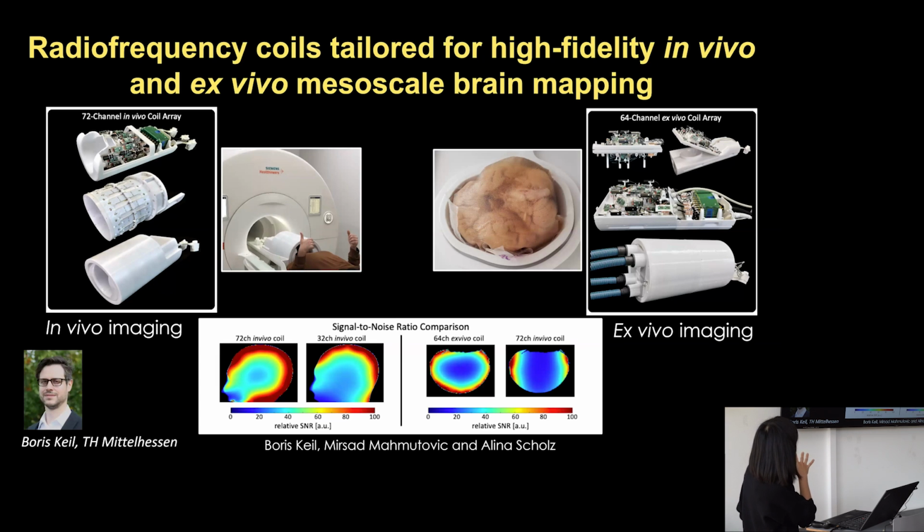In terms of the radio frequency coil, these were also very elegantly designed by Boris Keil, who's now in Mittelhessen. He really tailored these radio frequency coils to have optimal form factors to get optimal sensitivity. And I do think that these coils really make the scanner. They complete the picture.